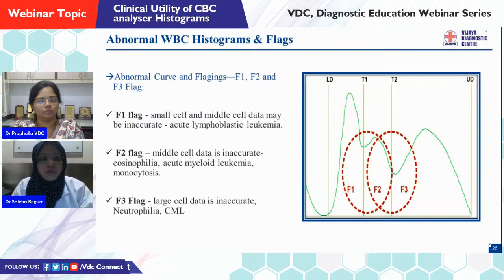Coming to this version of the histogram, here you can see three flags, F1, F2 and F3 flagging. F1 flagging: the small and mid cell data may be inaccurate. The machine is able to place the discriminator, but it still gives us a flag for review, to give us an indication that this data is calculated but may be inaccurate depending upon the morphology, as in cases of acute lymphoblastic leukemia.